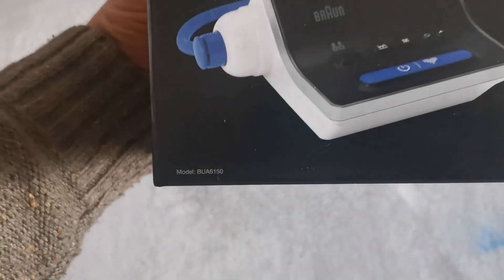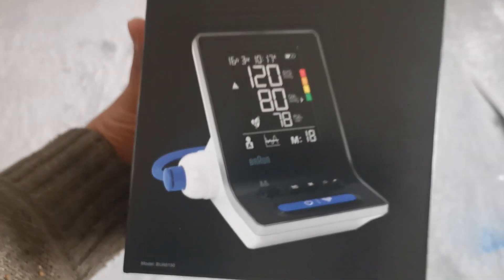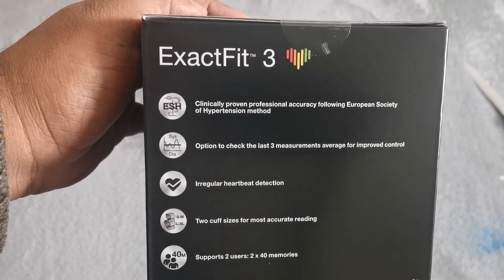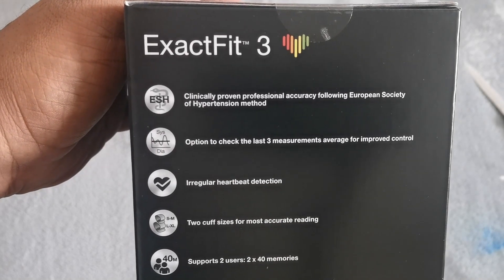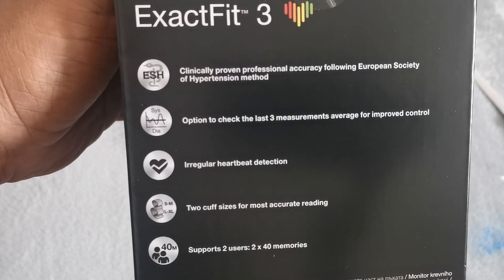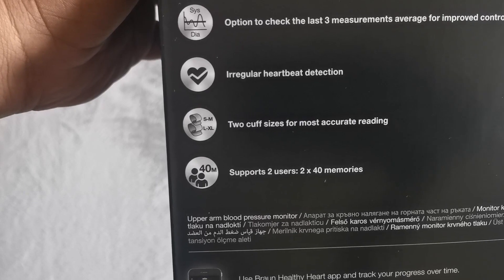The model number is BUA6150. I think you can see that. So what can this do? Clinically proven professional accuracy following the European Society of Hypertension method. Option to check the last three measurements average for improved control. Irregular heartbeat detection.